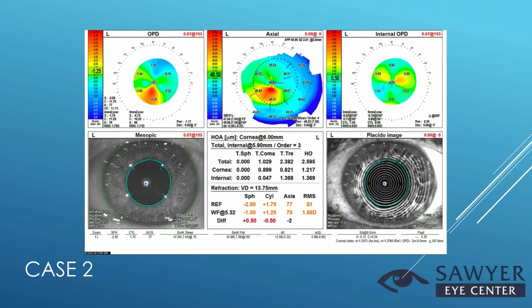You're going to have some just because of the way your cornea is shaped. But we will try to minimize it because you do have a visually significant cataract and at least hopefully improve the quality of the vision in your eye. I actually tried a superficial keratectomy on him first to see if I could smooth this out. It did not. I allowed about 2 or 3 months and it just stayed the exact same topography. So, decided to go ahead with cataract surgery.